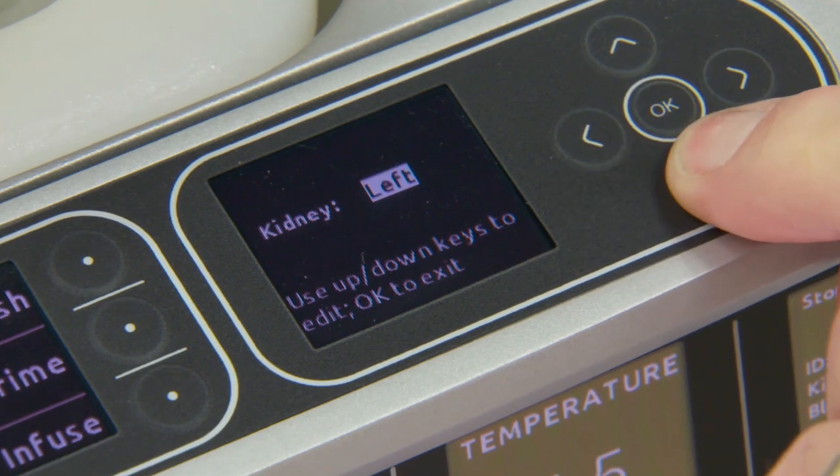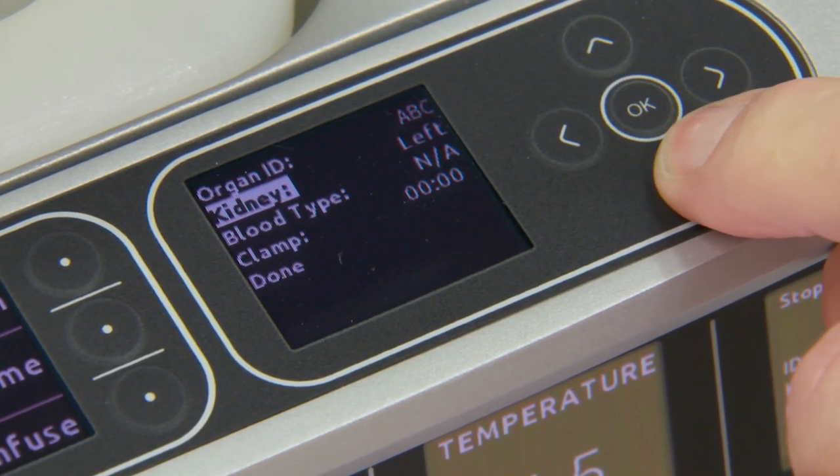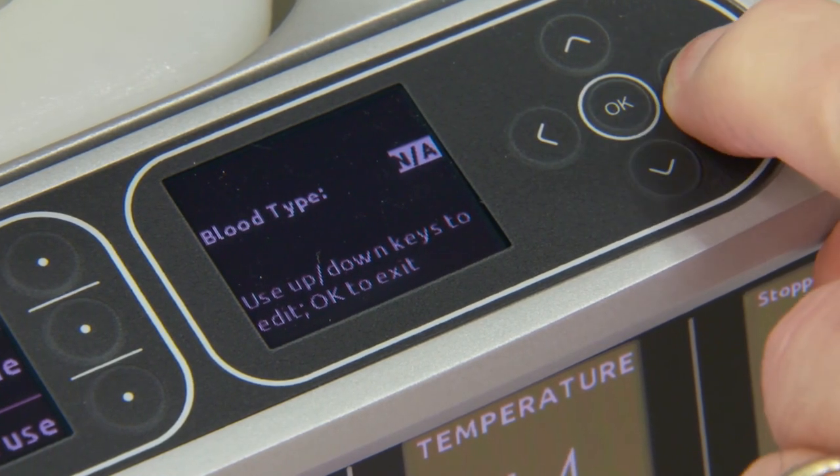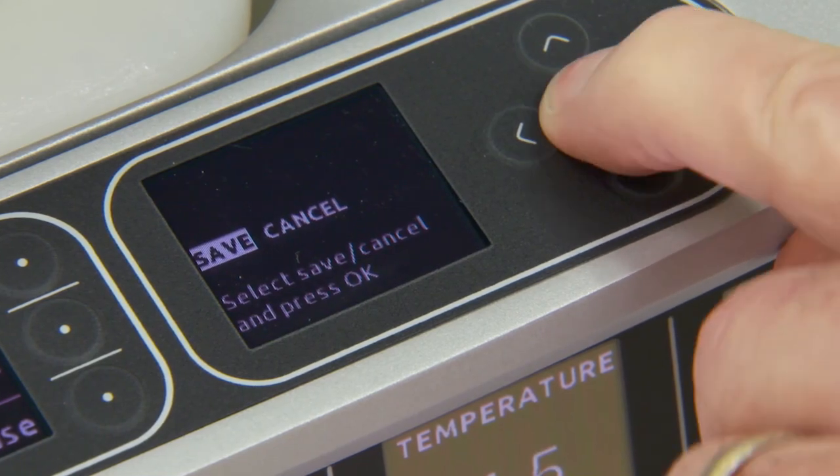For Kidney, you will have the options of left kidney, right kidney, or NA. As for blood type, there will be no subtypes. You will have A, B, O, and AB as options. Once completed, press Done.